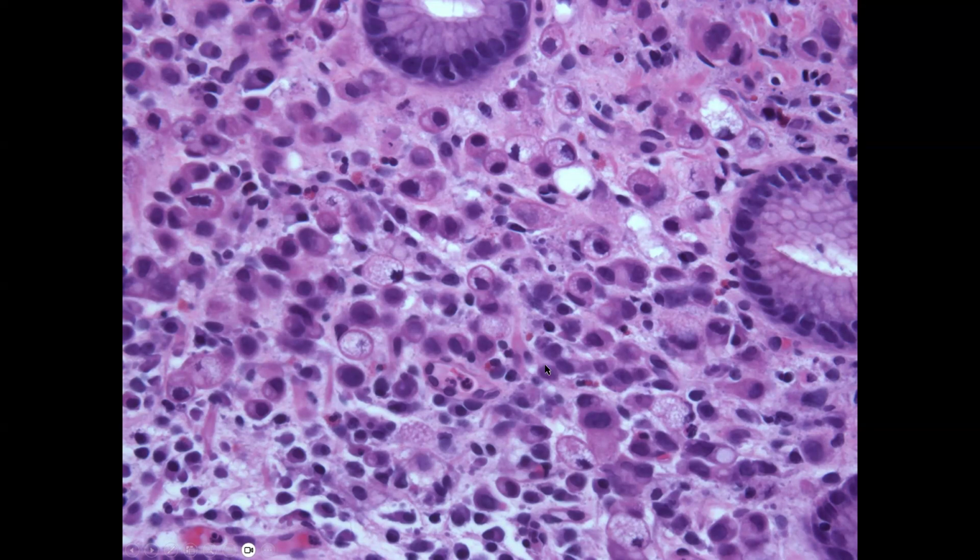And so when we appreciate the individual histology of some of these cells, you can see that there's actually a distinct large mucin vacuole with the nucleus pushed to the periphery. And so this is the classic signet ring cell that we see in discohesive type adenocarcinomas. The classic example is in the stomach, but these can occur anywhere in the GI tract.